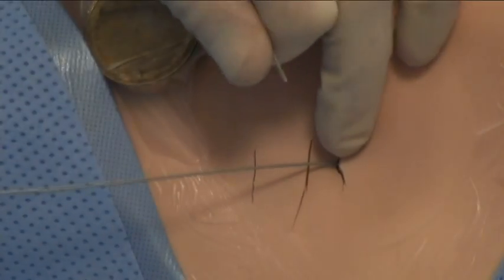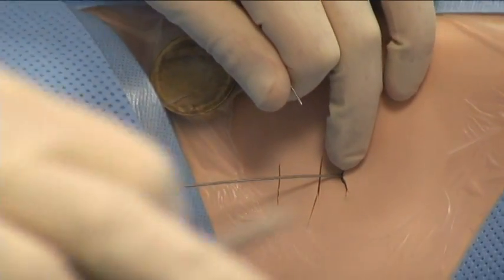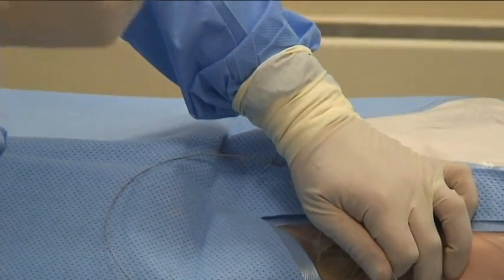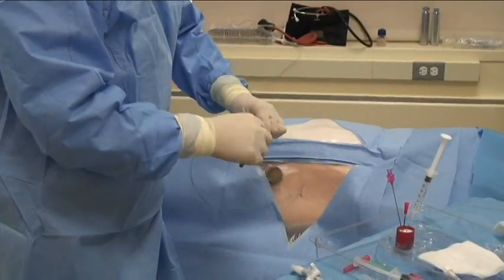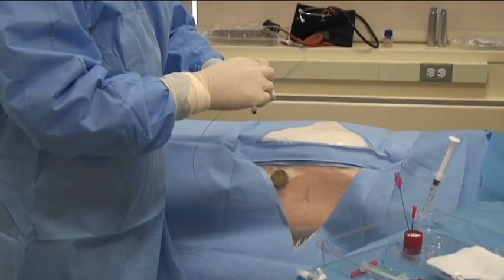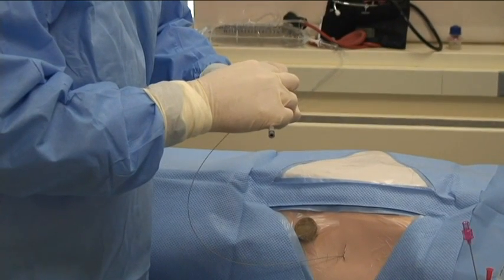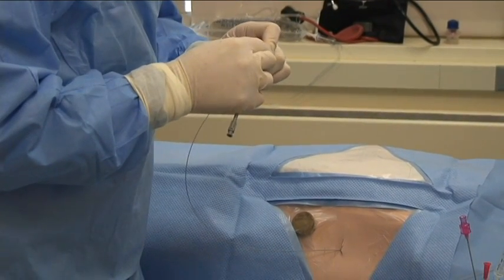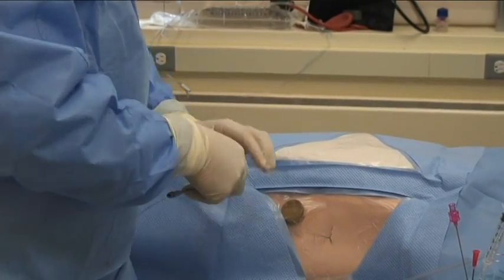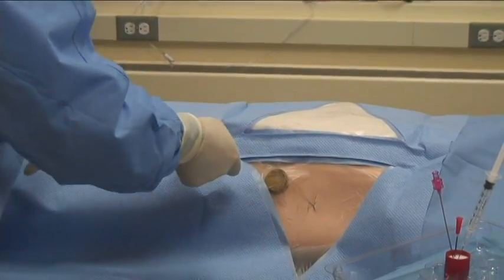At this point, you need your dilator. You will not be able to get your tube into the chest wall space unless that track is dilated. It's very hard to get in without having it priorly dilated. So I'm going to put the dilator over the wire. Again, never letting go of the wire, as in any Seldinger technique.